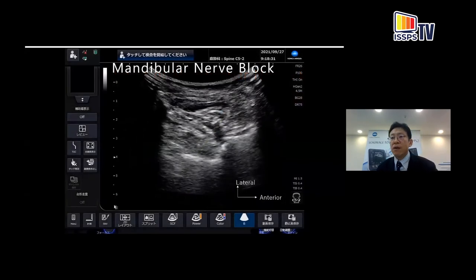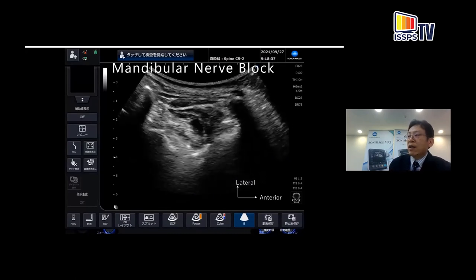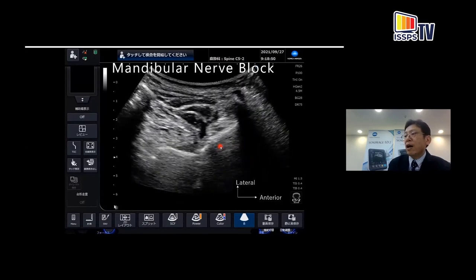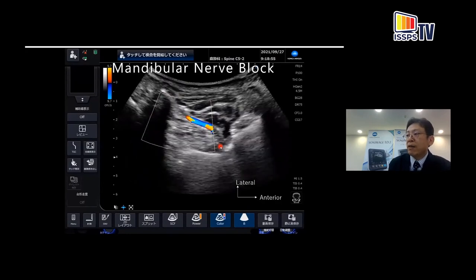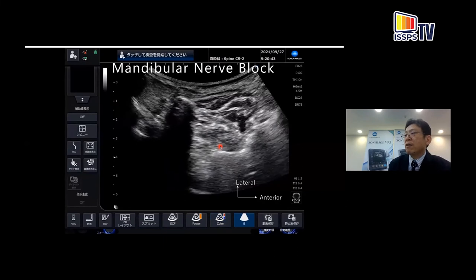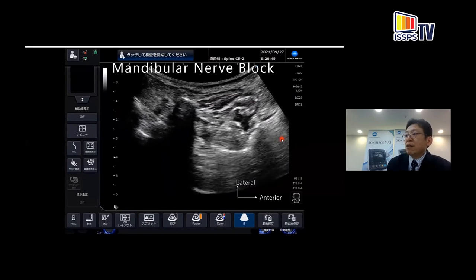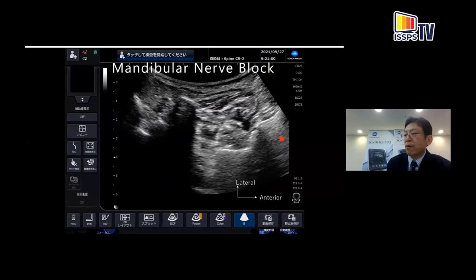This is a video of the mandibular nerve block. First, I visualize the skull base. Here is the skull base and the inferior orbital fissure. Now I visualize the uppermost lateral pterygoid plate and check the maxillary artery. I then insert the needle, touch the posterior border of the lateral pterygoid plate, and inject the local anesthetic.